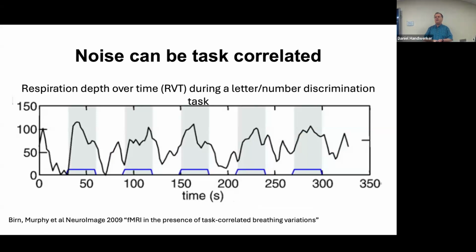The multi-echo talk, well, if you've already collected data, you can't collect multi-echo. But there are various methods. I would say any ICA-based method has the potential for separating a respiratory artifact from something task-related that's similar, because if they have a slightly different spatial pattern, it gives you the possibility. But it is hard. Nothing I said is going to be perfect. So knowing your data and your applications really comes down to it.